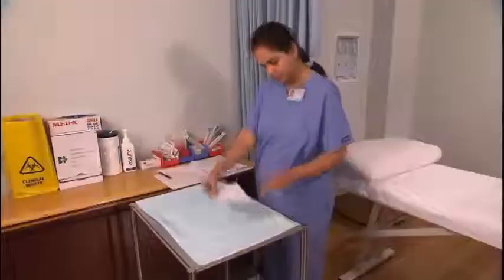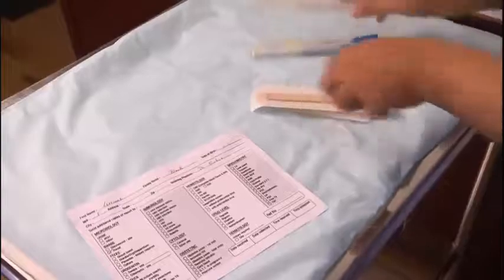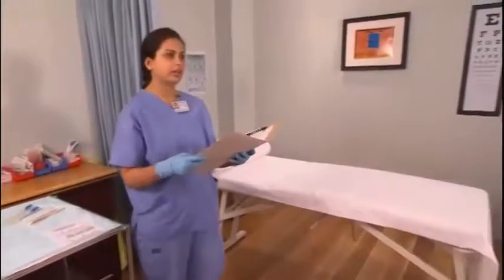Wash your hands, review the laboratory requisition form, and prepare the tray for the procedure. Put on gloves. Confirm the patient's details and explain the procedure. Then obtain verbal consent to proceed.